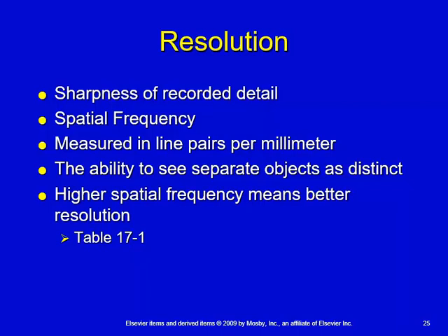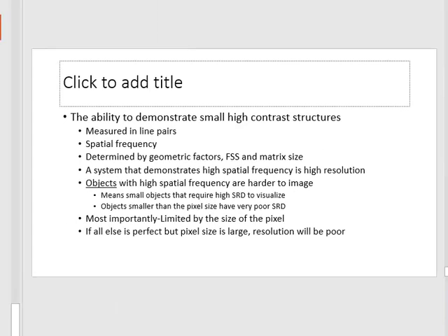So spatial resolution is your measure of spatial resolution. It's measured in line pairs per millimeter, and it's the ability to see separate objects as distinct. And the higher the spatial frequency, the better the resolution. I'm going to bring a couple of things over and show you.